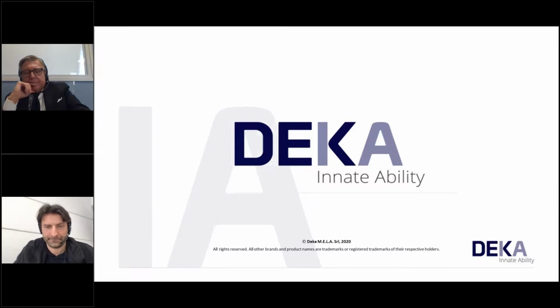Well, there is a range where I move my criteria, and normally the range, just to give you the possibility to move in a smooth modality, I move in the range of power that is between around 8 up to 12, sorry, as a power, and depends of the deep layers that we have to penetrate, in the sense that if we have deep acne scars, we use 12 watt and stack 3.